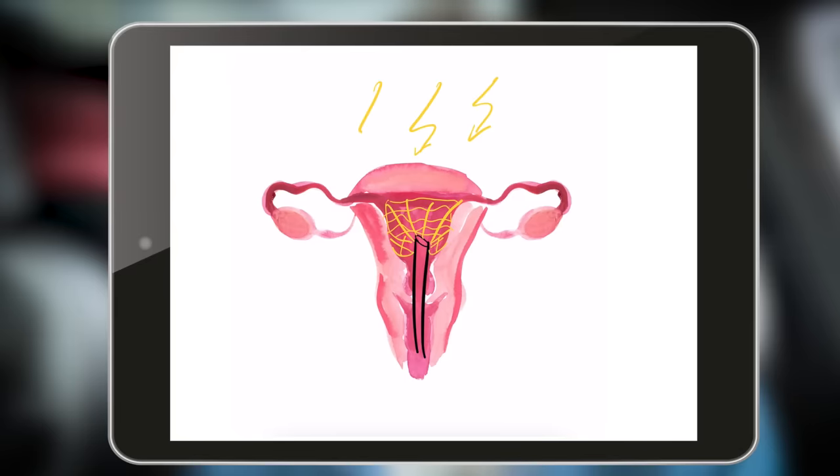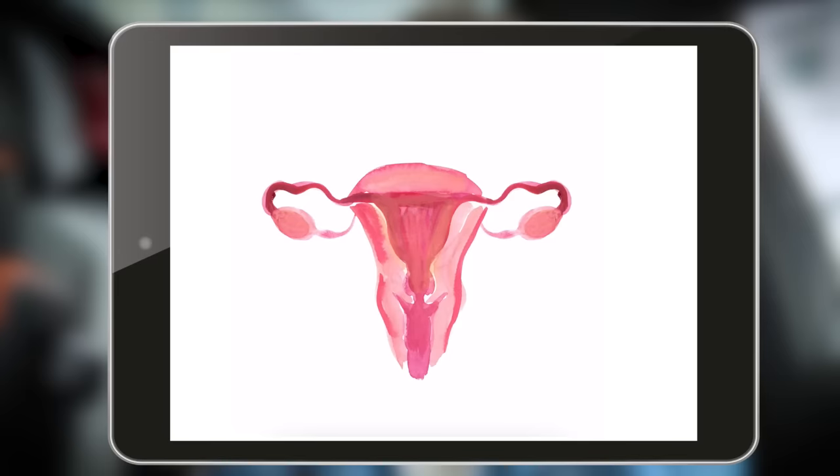Then it can basically start. High-frequency electricity is applied to the golden network, which oxidizes the uterine mucosa. Afterwards, the result is checked again with the camera inside the uterine cavity — whether everything has really been treated and whether there is any bleeding. Then all instruments are removed. So much for the theory; now we want to move on to practice.